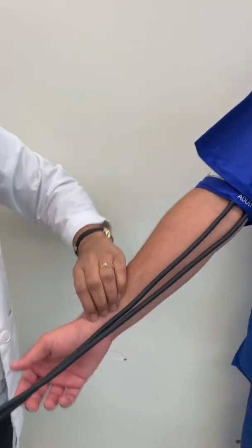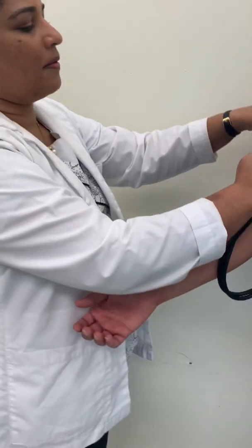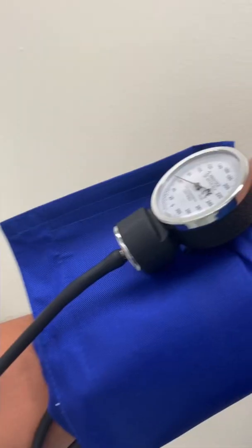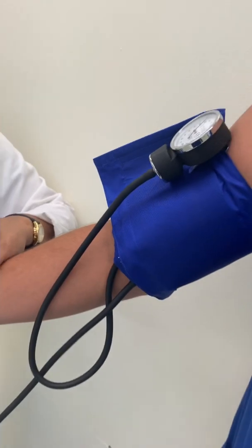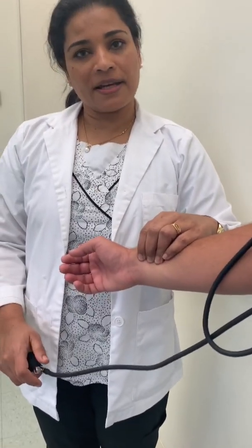Feel the radial pulse and inflate until you don't feel the radial pulse. It disappeared at 120. So I'm going to add 30 to that, meaning next time when I inflate, I have to inflate up to 150.